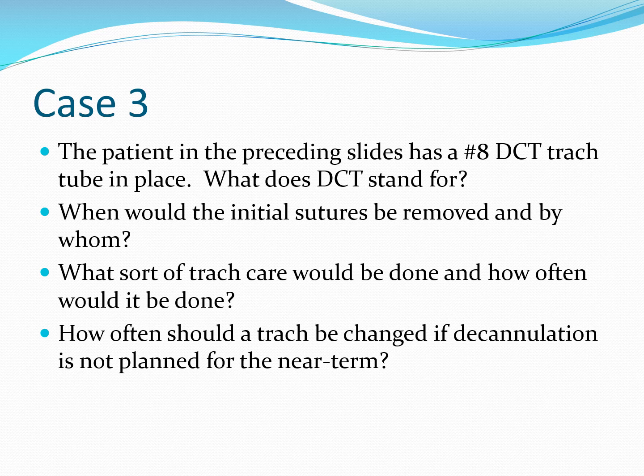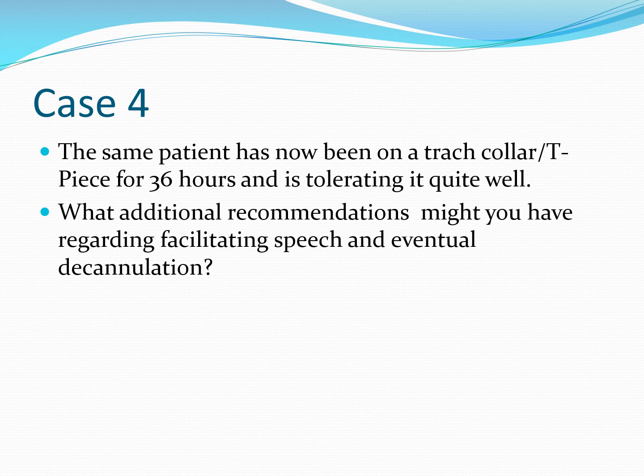They're in an acute care hospital. They're going to a long-term care facility. Good idea. Maybe change it right there in the acute care hospital, so it would alter that interval when the clinical situation warrants it. Case 4, just like case 2 is a continuation of case 1, case 4 is a pseudo continuation of case 3.